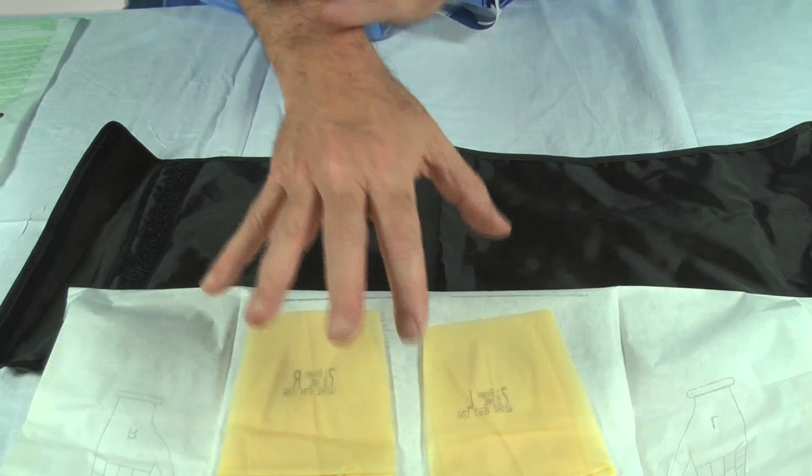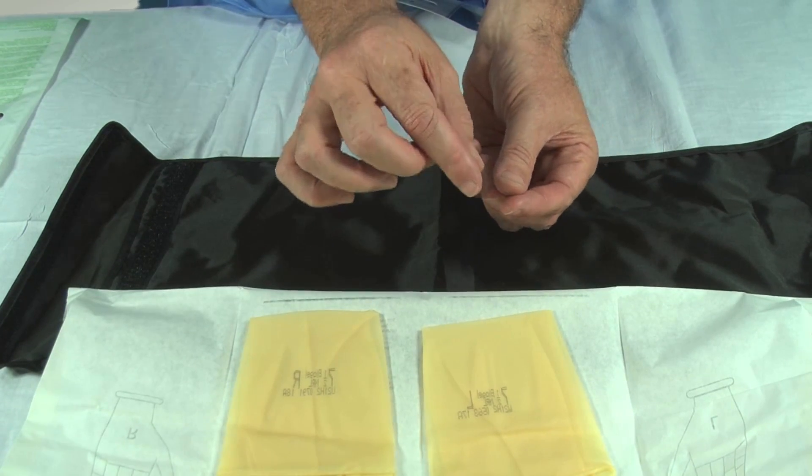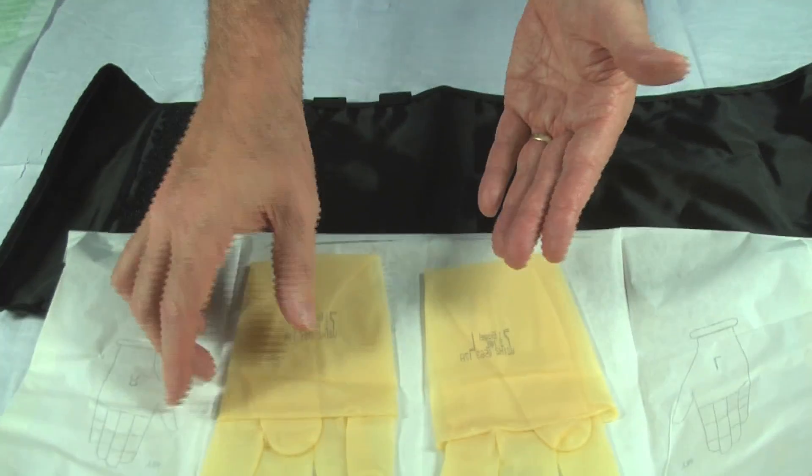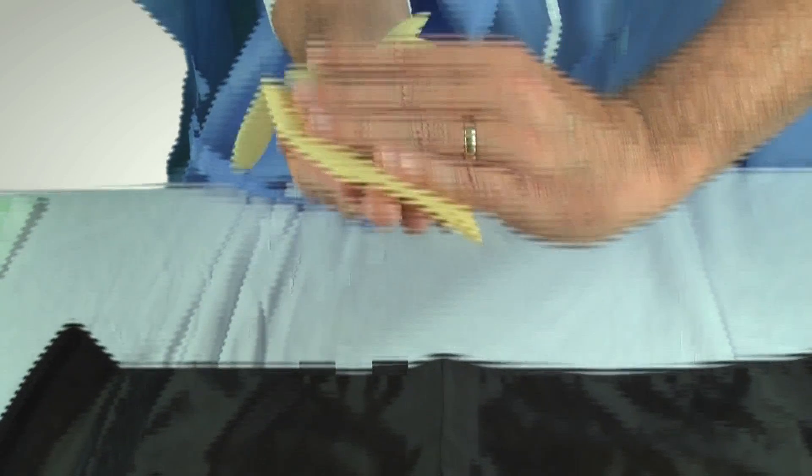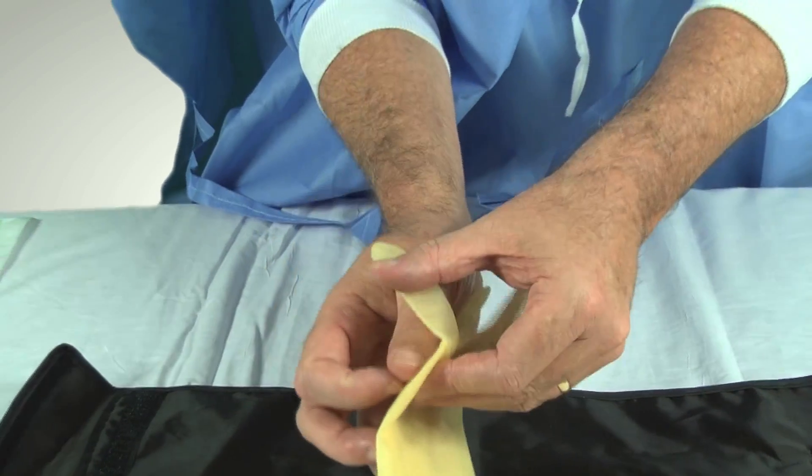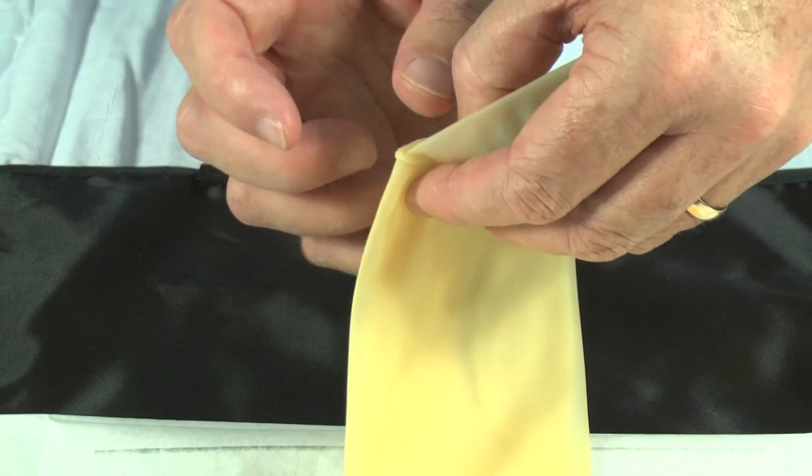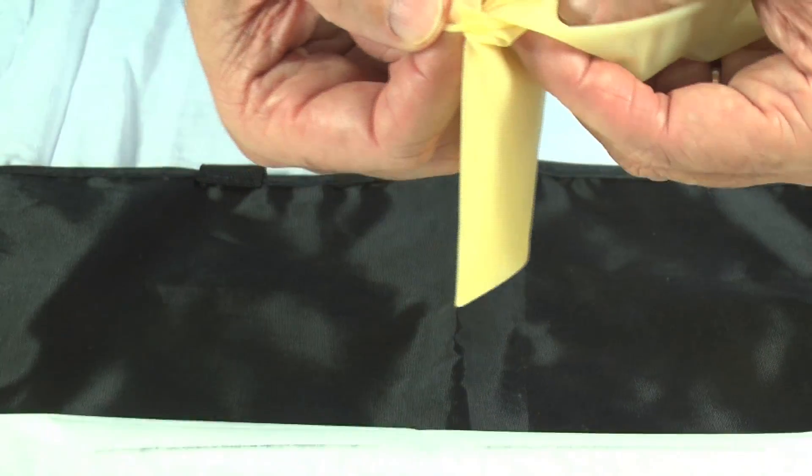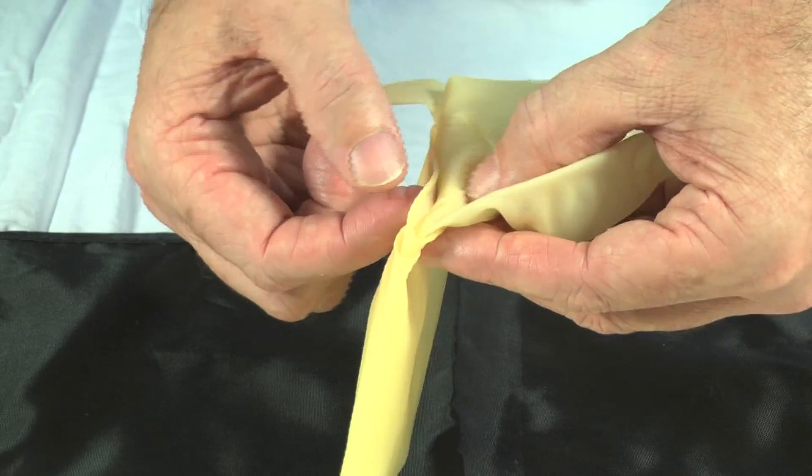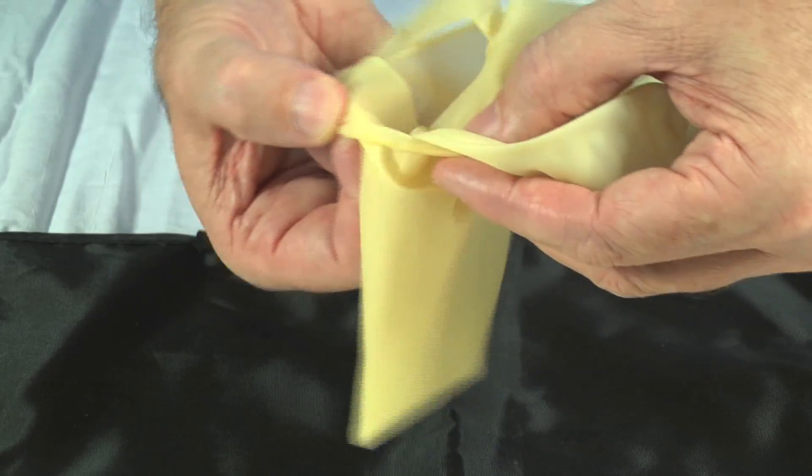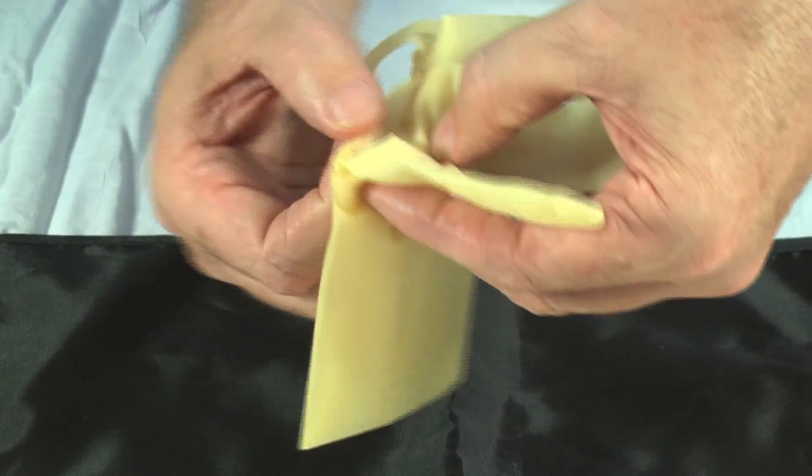Now this time I'm doing this without the gown, so obviously you wouldn't do it this way, but I'm really doing this just to emphasize what it is I want you to be grabbing. So, you make the fingers point towards you, and I'll put this against the backdrop here, black. You make sure you grab this and this alone. See that? This and this alone. Not this and the thumb. That will gum you up as I demonstrated earlier.